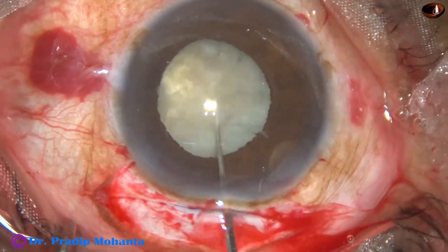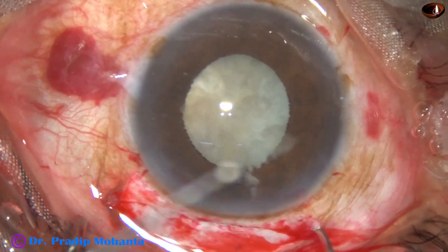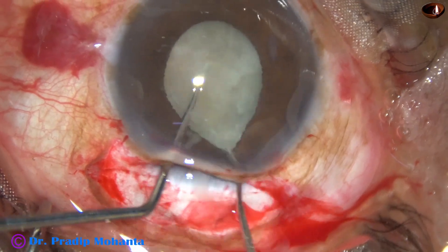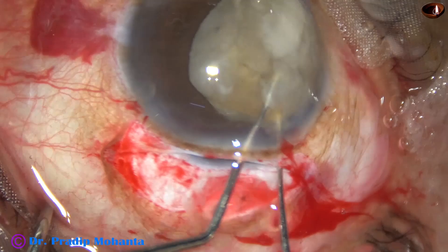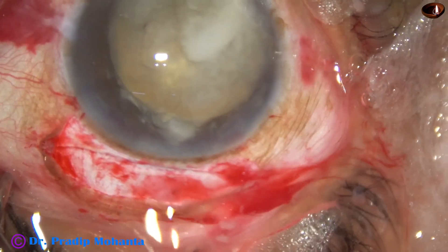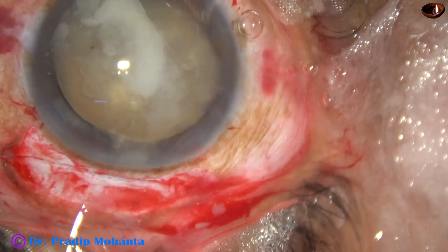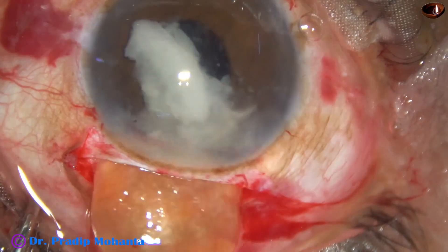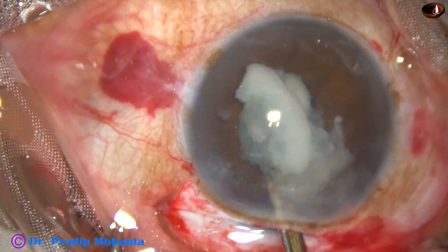Because the pupil is becoming small, but once we convert to SICS, that is much safer even if the pupil becomes small. The nucleus is prolapsed into the anterior chamber. Viscoelastic substance is injected both in front and behind the nucleus. Again, I use the visco-hook, and the nucleus comes out very smoothly.